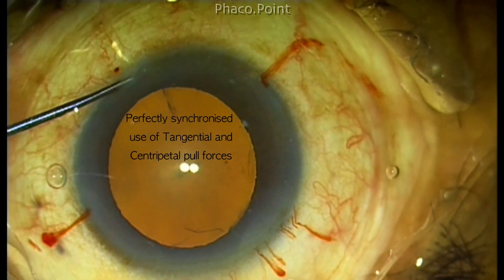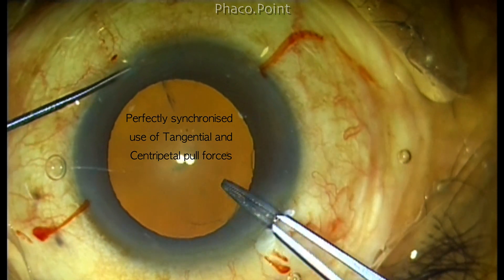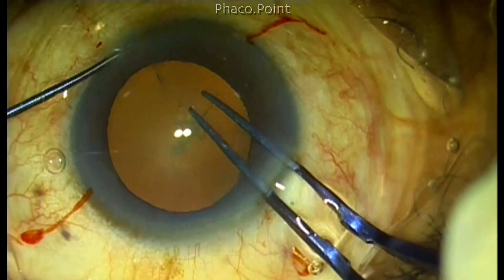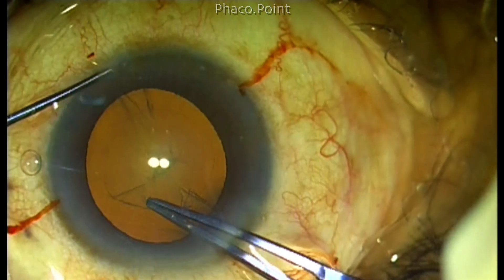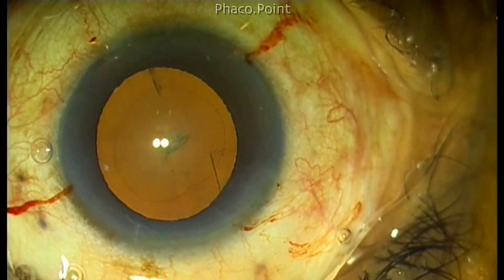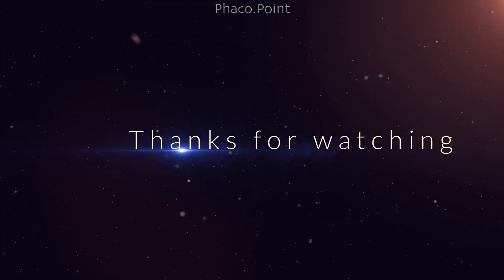This is the ideal way in which you roll and adduct your wrist to complete the capsular rhexis using both tangential and centripetal forces. You see the beautiful synchronization of both pull forces acting together to create a beautiful, nice, round rhexis. Thank you for your attention.